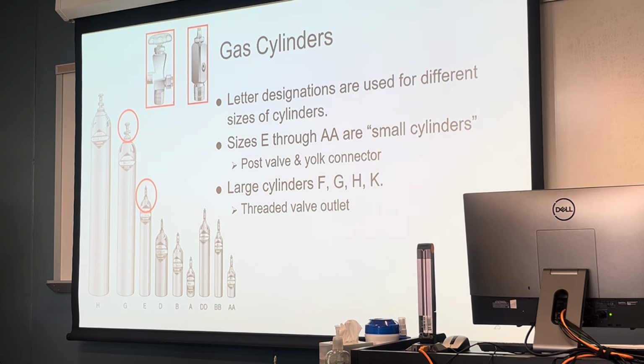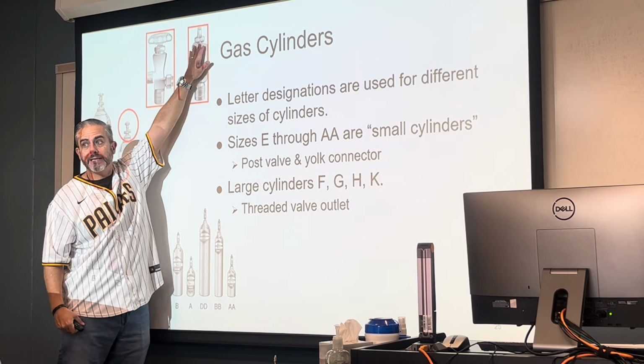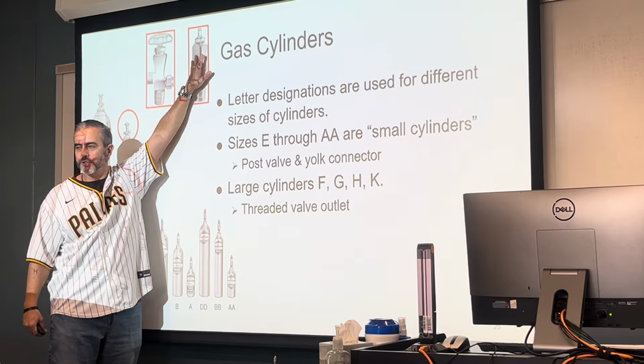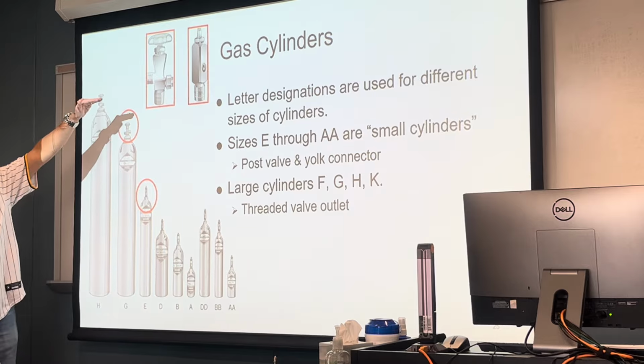Now some of them do have their own permanently attached key. It makes it really easy to turn. But if it's one that looks like this, you would need a special key. I can use a wrench or a pair of pliers and make it work too. But we generally have keys that fit right over the top of it.